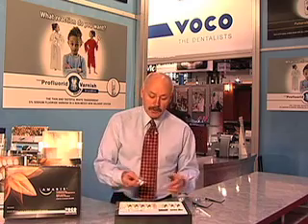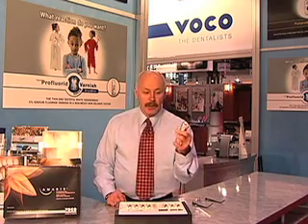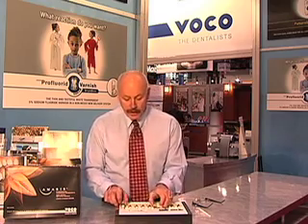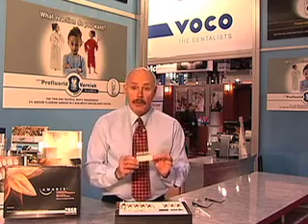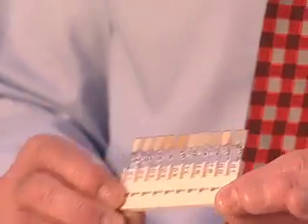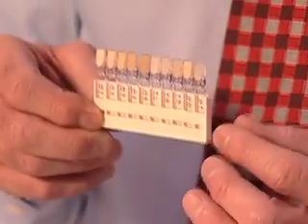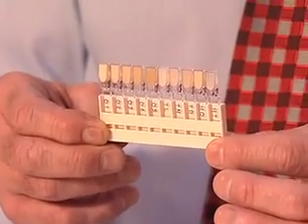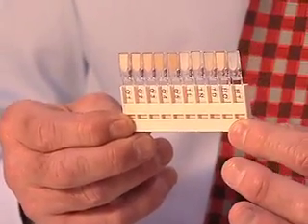This system is interesting because the composites come in easy-to-dispense syringes and compules. Another very appealing feature is the actual shade guides themselves. You can preview these in the mouth with your staff and train your assistant to understand the optical characteristics between opaque one through five, the translucent shades, and the flowable shades as well as the analogs.